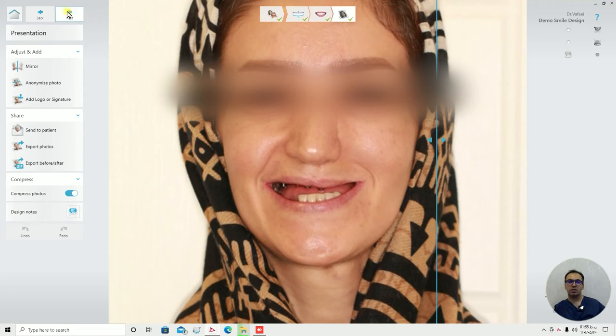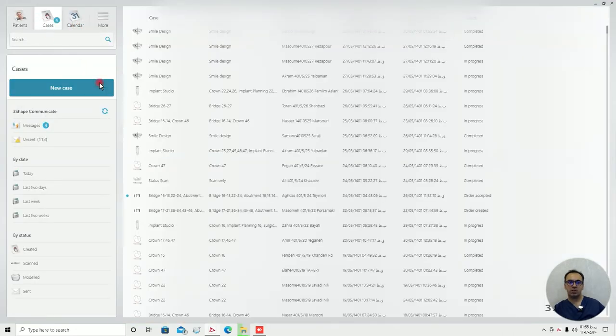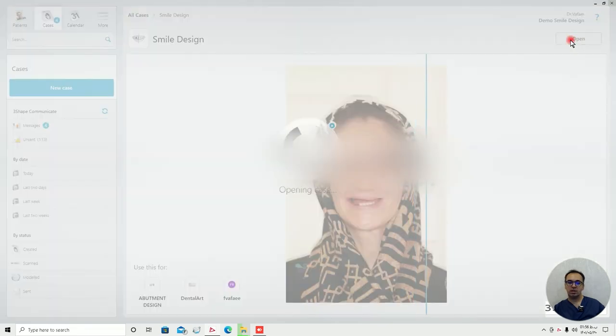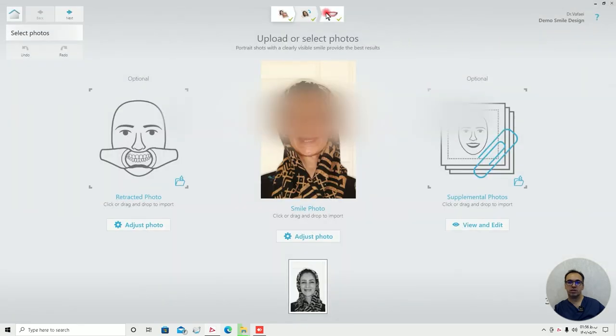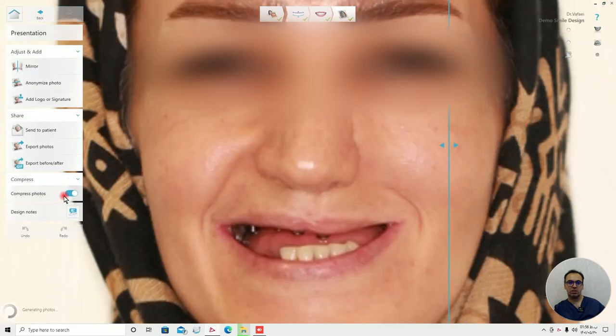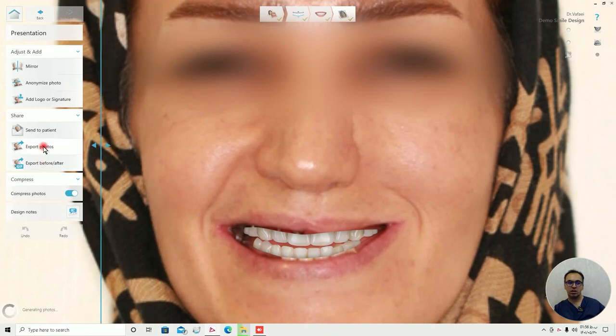And that's because the teeth are deviated from the eyes. Thank you everyone, I hope you all enjoyed this lesson. And of course you can use this lesson to demonstrate to your patients how they look after doing surgery, implant, restoration, or whatever else. And you can send the photos in case you need to send photos to the patient.